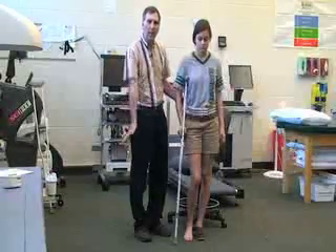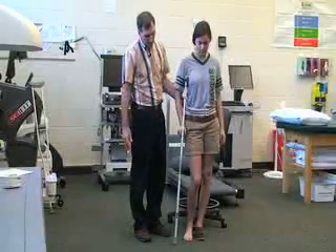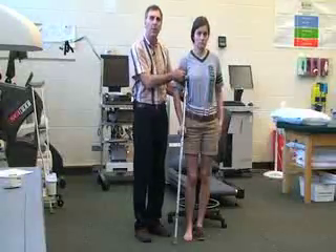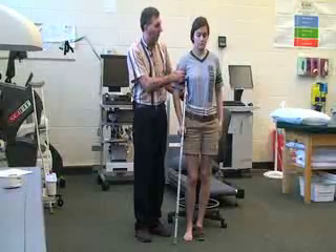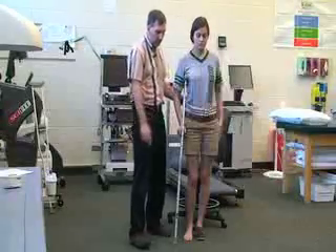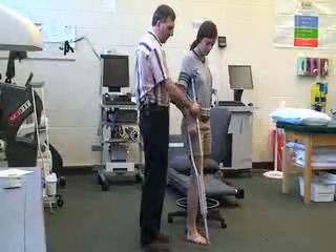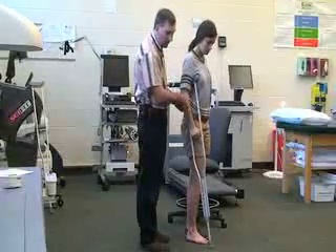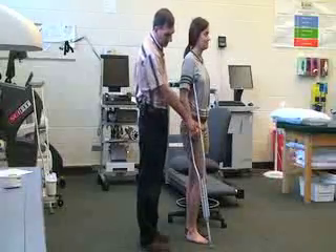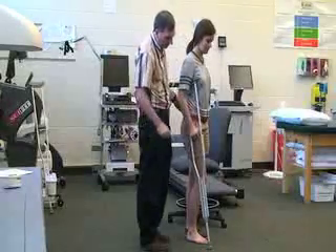She's going to put the heel of her hand onto the crutch hand pad. Next we want to make sure there are about two to three inches of space between the top of the armpit and the top of the crutch, which there is. We also want to make sure the elbow is bent at about 25 to 30 degrees, and if not we can adjust it. I'm also going to flip the crutch around so that the screw faces forward so it doesn't cut her.